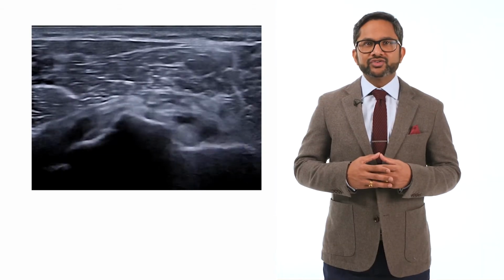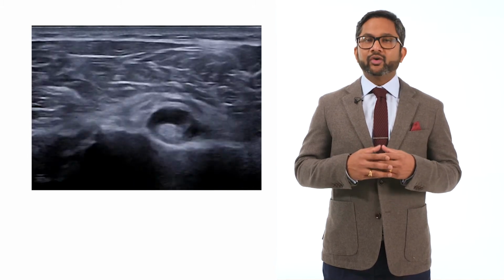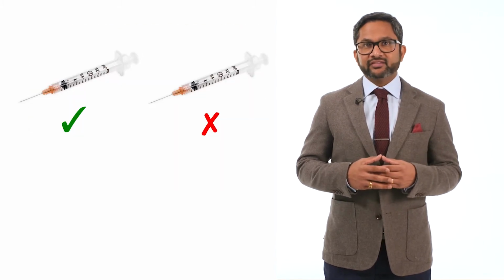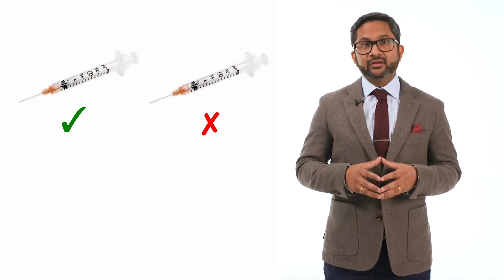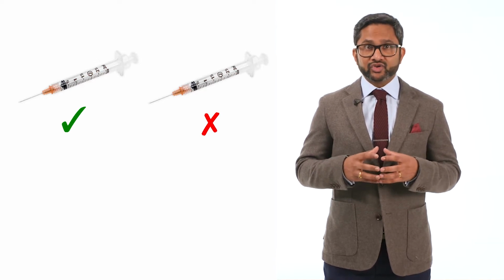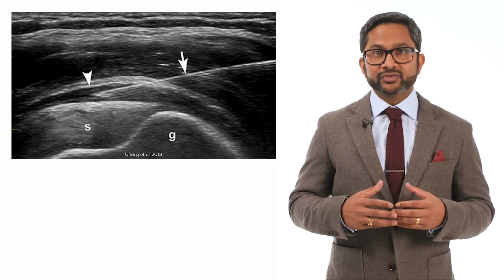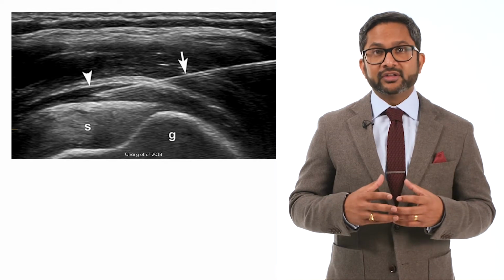Advances in ultrasound technology allow static and dynamic real-time evaluation of musculoskeletal tissues and offer real-time radiation-free guidance for injections. The main philosophy behind ultrasound-guided injections is that one can screen the tissue to inject or not to inject, and if there is an indication to inject, then this can be done targeting pathological tissues. Undoubtedly, ultrasound guidance provides an additional margin of safety for injection techniques because the needle shaft, tip, and the target structure are constantly visible in real time.